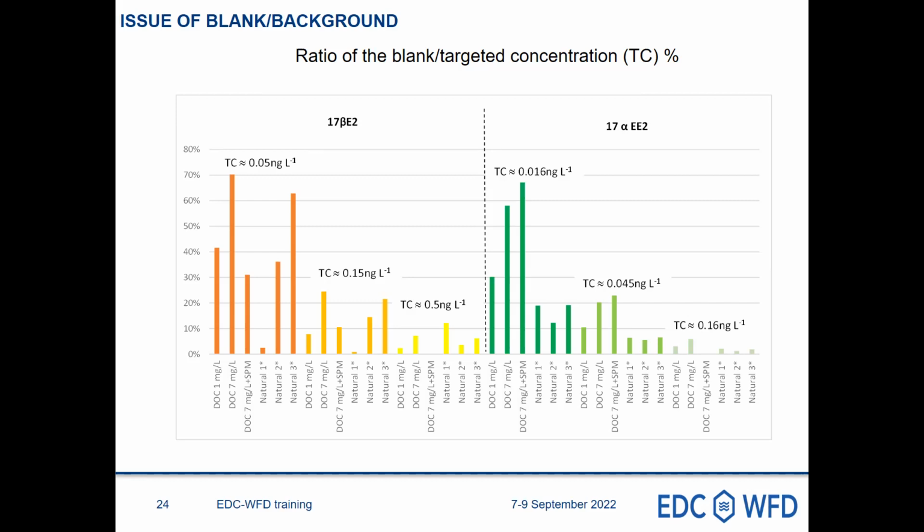You demonstrate that you are capable of accurately measuring an amount equivalent to the targeted LOQ, but you do not demonstrate that you are intrinsically capable of quantifying this LOQ. It is a big difference. So it is really tremendous. And we have many issues in the project to fully demonstrate the performance of our method.